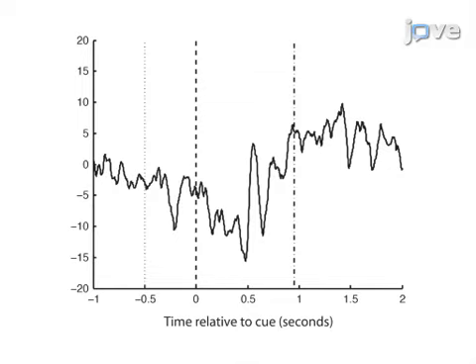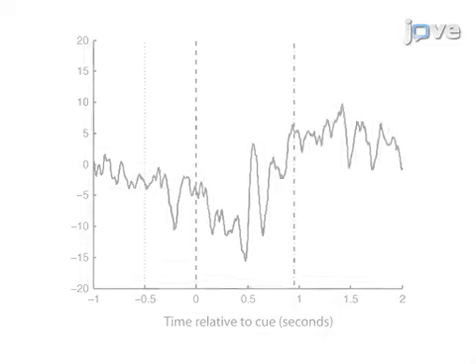Ultimately, multi-tapered spectral analysis is used to demonstrate variances in the local field potential activity in the dorsal anterior cingulate cortex depending on the difficulty of the cognitive task.